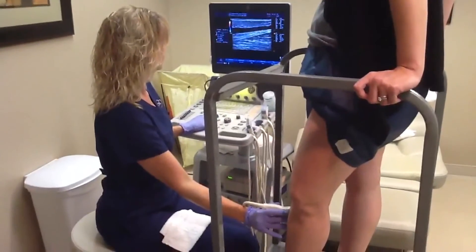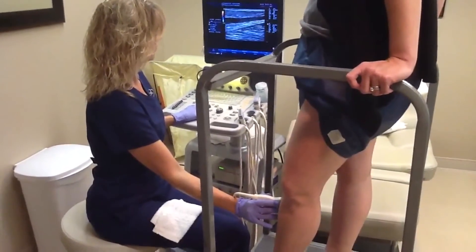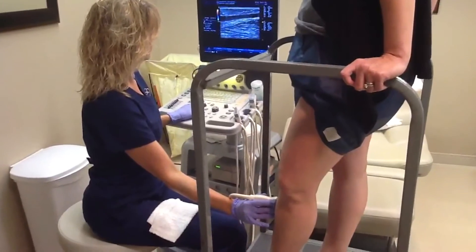This is an example of an ultrasound examination of the legs, which we do for patients who come in with varicose veins. As you can see, it's non-invasive and totally painless.